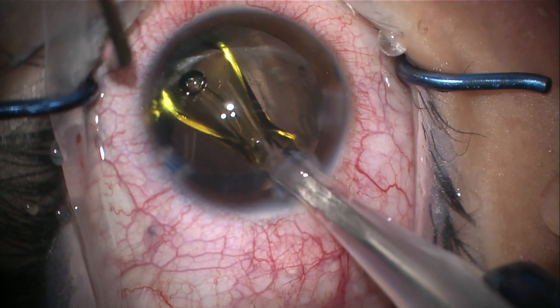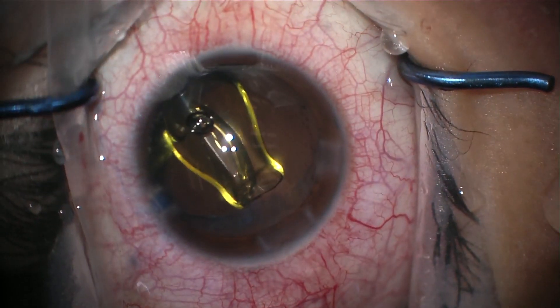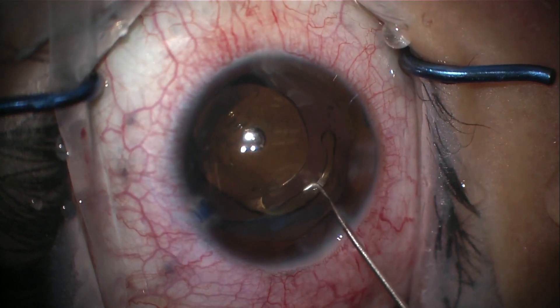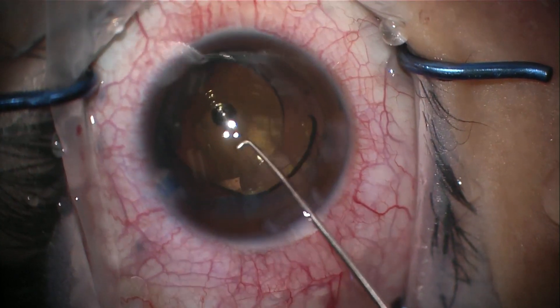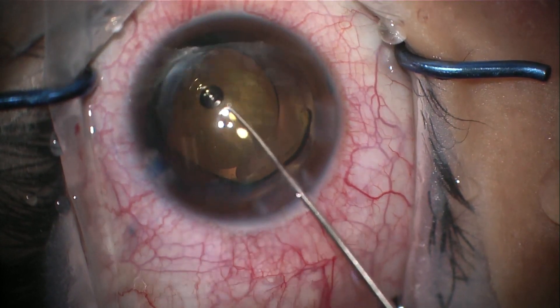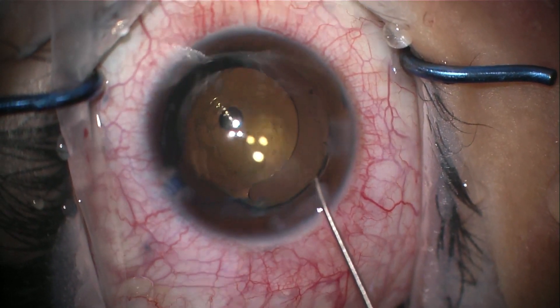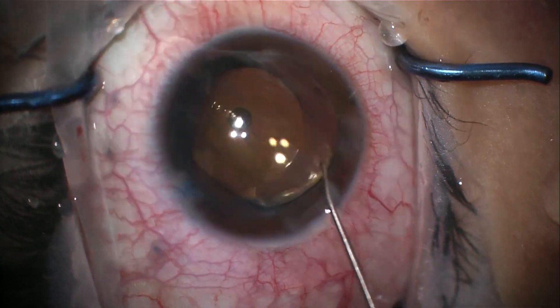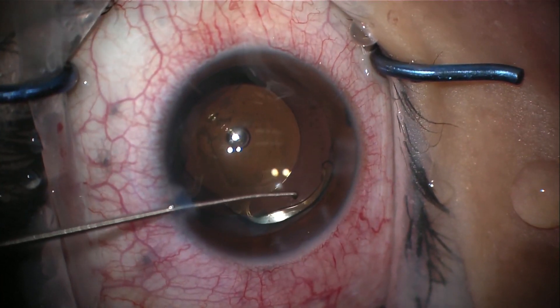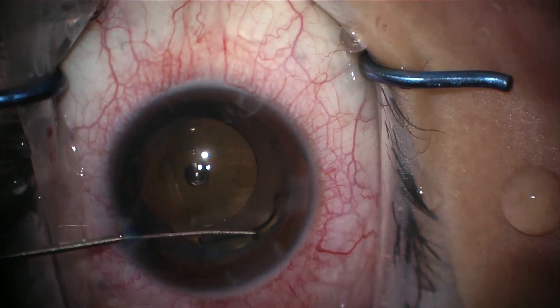A single-piece acrylic lens is placed within the capsule, with the haptics positioned 90 degrees away from the capsular tear. This gives the haptics a secure footing within the capsule and allows the forces from the haptics to be as far away from the tears as possible. Using a Sinski hook, the haptics are tucked behind the anterior capsular edge.